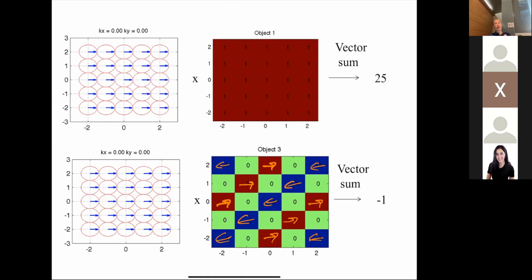Now, the other issue is contrast, which we'll get to later. Even if you have very high resolution, if there's no contrast at that level, then you're not getting any more information, right? For example, in the brain, maybe the contrast you're looking for is the different layers, but within every layer you may not have enough contrast to differentiate within the layer. So if you scan beyond that, then maybe you're not getting the information you need. But yeah, in principle, you could just scan forever.